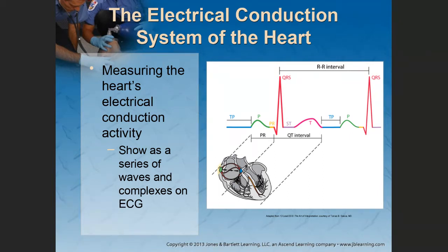There are other things that I need to talk about, but these are essential. So the P wave, atrial depolarization or discharge, when the atria discharge current. The PR segment, which is flat, is when the atria recharges or repolarizes. Then we have the QRS complex, which represents ventricular depolarization or discharge. Then we have the ST segment, where there's a drop in electrical activity. This is where the heart muscle will take its blood supply.